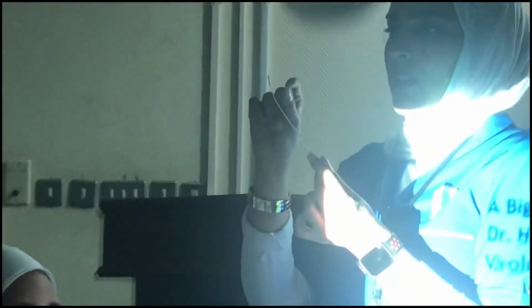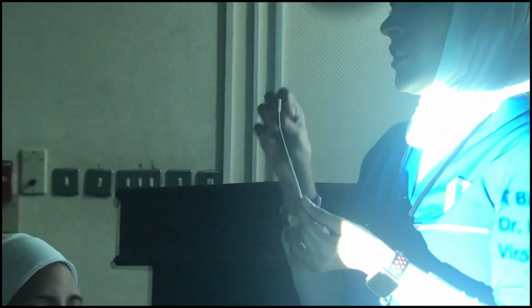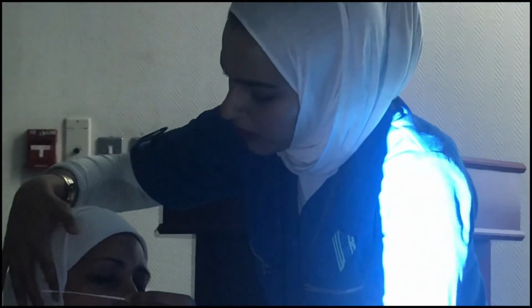If you see, it has little delicate hair that can take little cells from the nasopharynx. And if you see, we go all the way till here. And if you see, there is the distance. It is exactly from the nostril to the ear. So there is a lot of cells. I can see it here.